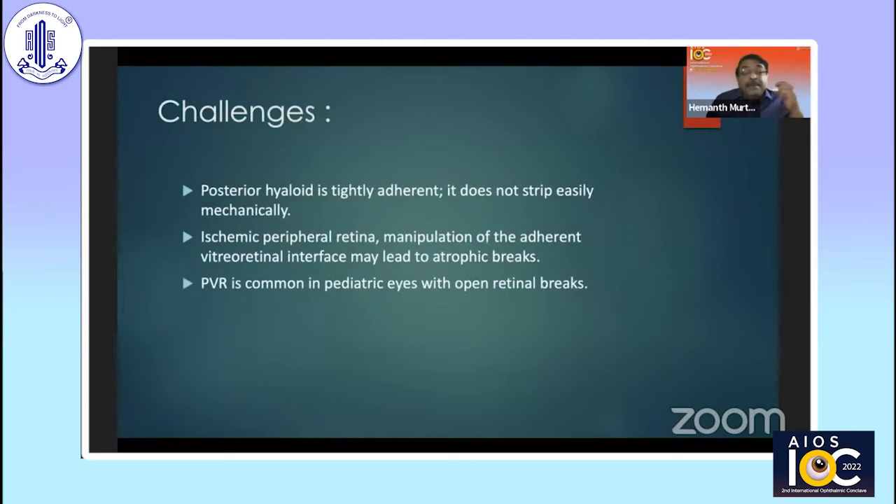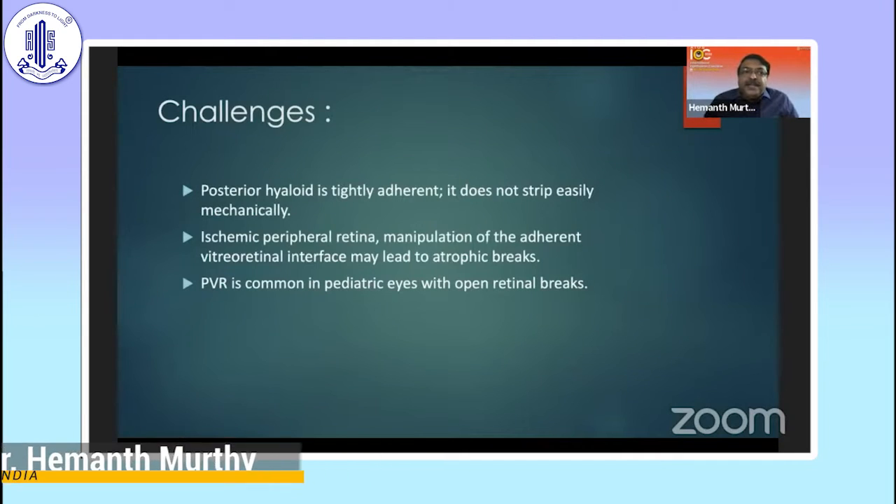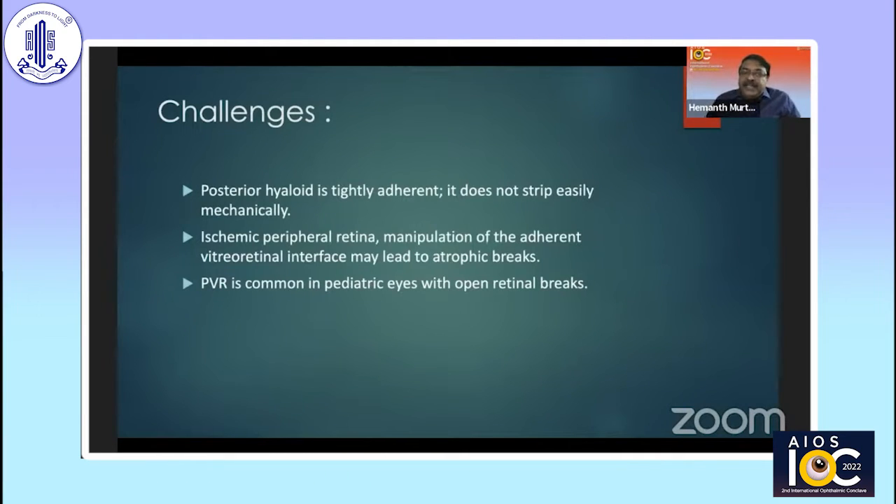Some of the challenges that we come across: the posterior hyaloid is extremely adherent and it doesn't strip off. It's always very difficult to manage these patients. It behaves very much similar to any other tractional procedures like ROP, where the contraction — once you develop more breaks — makes it very difficult to prevent PVR. In my patient, because I had previously done all the laser to the periphery, I did not use a buckle. Otherwise, there's good reason to put a peripheral buckle because you are never able to clear the vitreous entirely from the periphery.